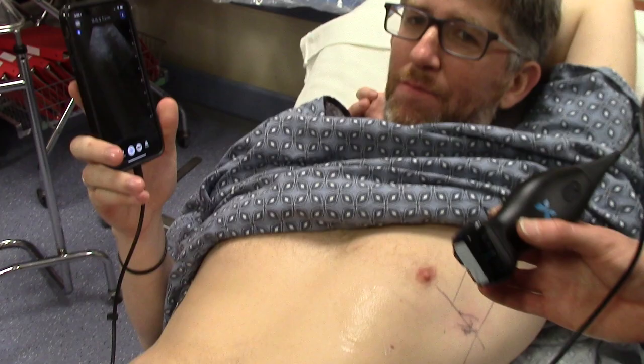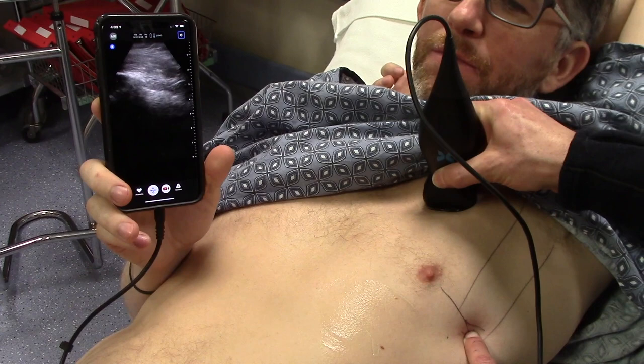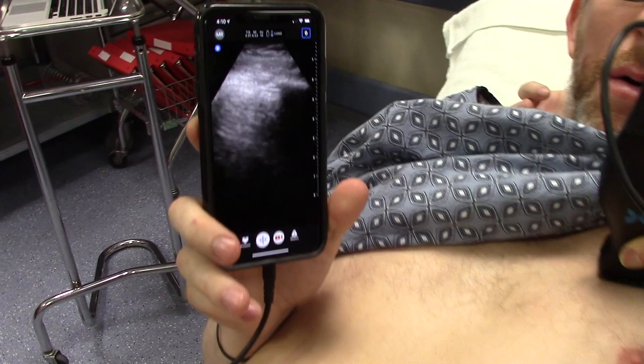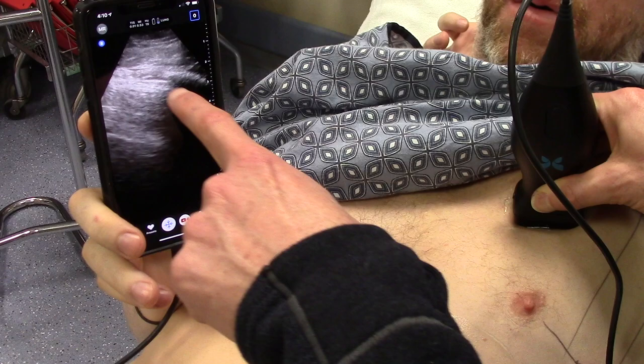With either technique, I've now got my chest tube in this space here. Let's say I did this for pneumothorax reasons — I'm going to come up here along the chest wall to the very anterior aspect. You want to be as high on the chest as possible, where any intrapleural air would be. And you can see here on Daryl — if you wouldn't mind taking a couple of good breaths for me — you can see this nice white line as he breathes, as it slides along here. And that is the pleura sliding back and forth.